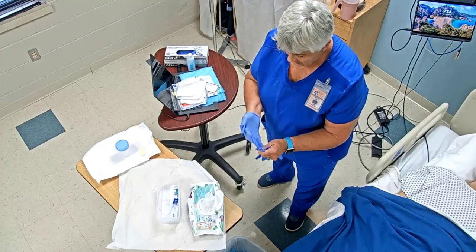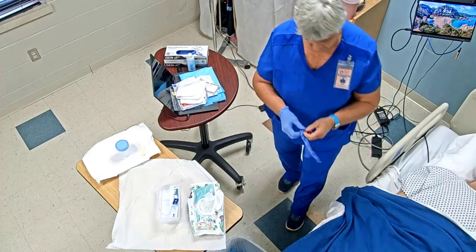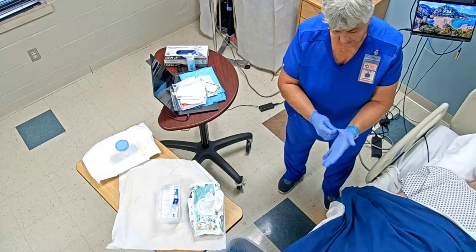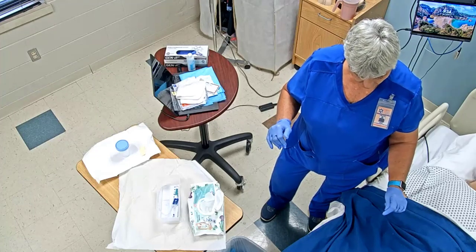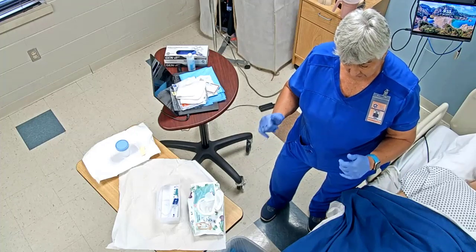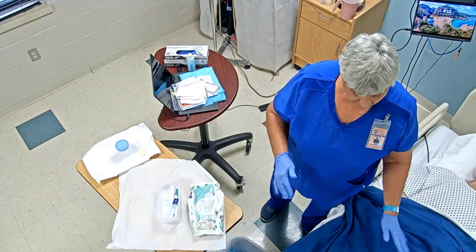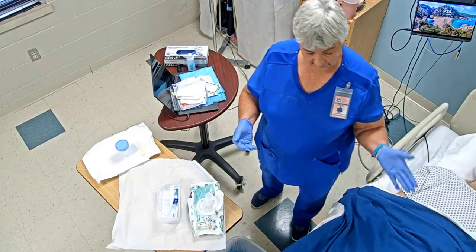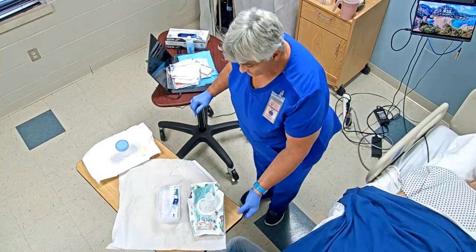Now, if we were doing a residual, because the patient is unable to void or not emptying their bladder completely, then before I started the straight cath, after they've already done a bladder scan and we're still needing to check, I would have the patient void as much as they possibly could, palpate the bladder, which is right above the suprapubic area, to see if I can feel the bladder, and then we would do the straight cath, and then afterwards we would measure how much was left in the bladder after they went to the bathroom, and we would document that, okay?